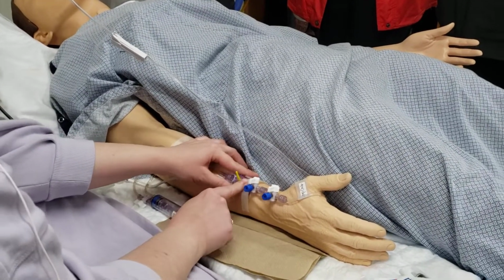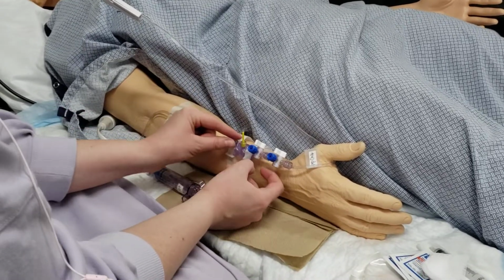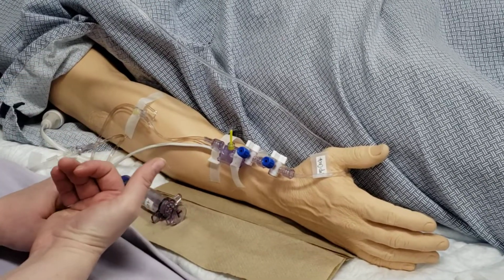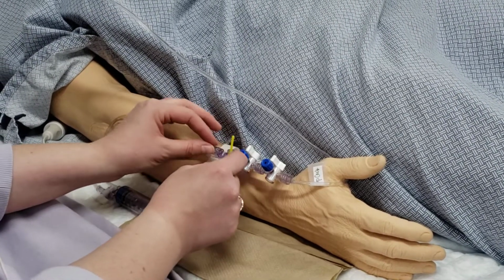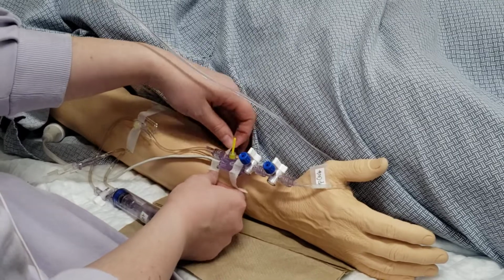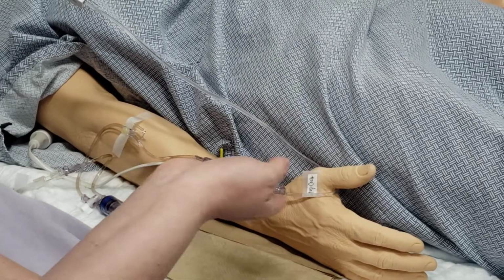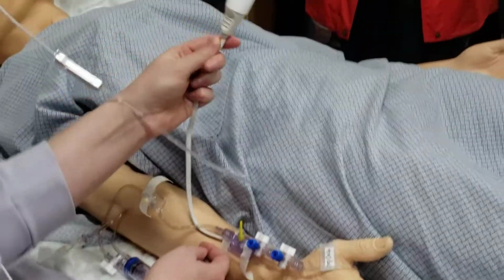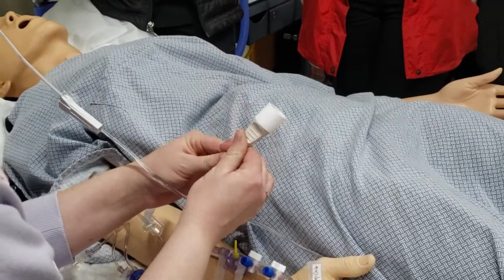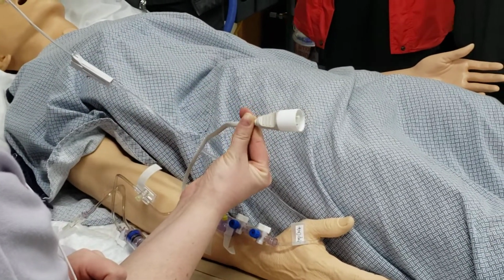With the transducer, this is where we would read the blood pressure. There's a little microchip or monitoring system, which would be where the blood pressure would read. That is where the monitor attaches, where the arterial line that connects to the monitor would connect.